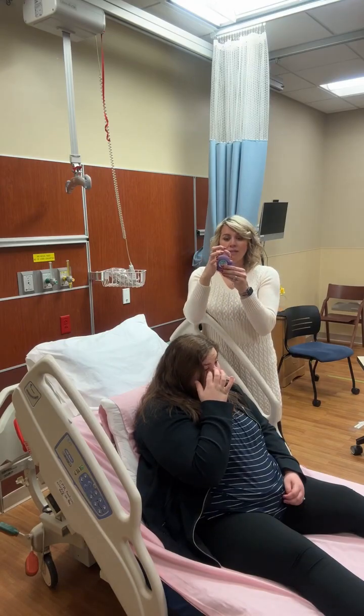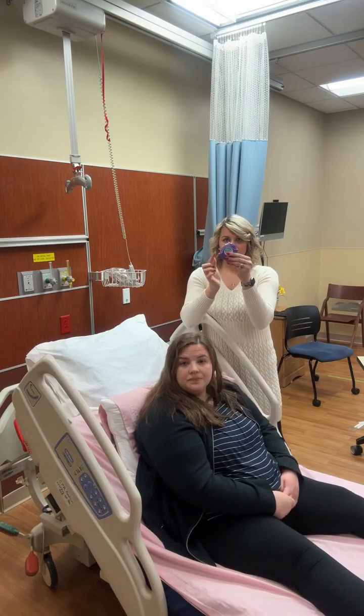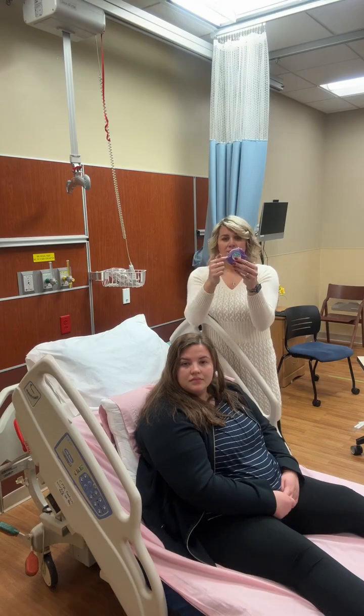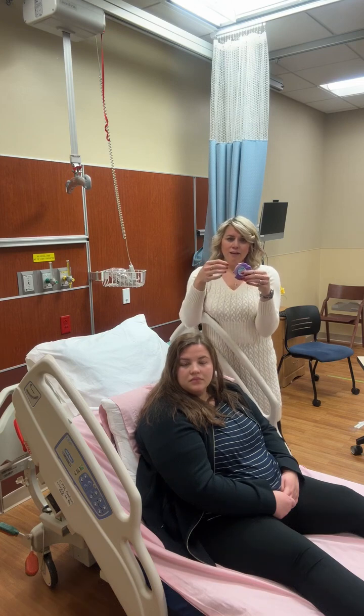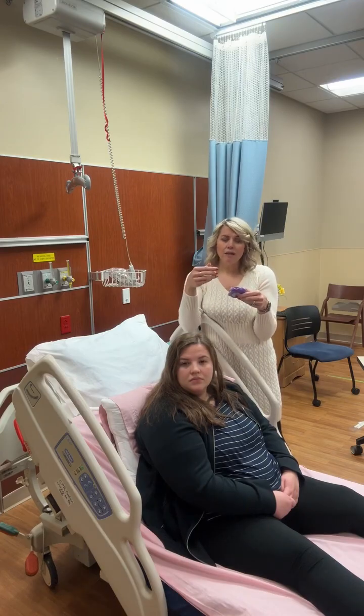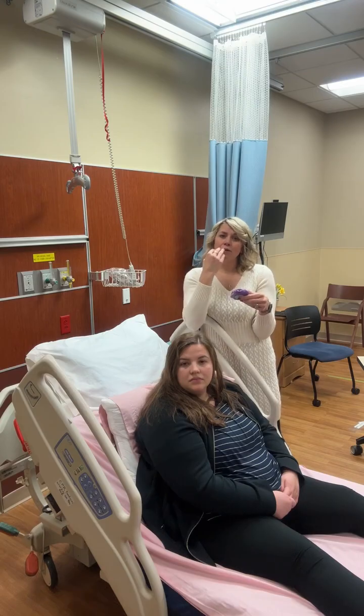So when we open this, like this, and then we pull this lever down, what we've just done is punctured a little capsule that has powder in it. And so when we do that, we've punctured the hole in the capsule so that the patient, when they put their mouth on this, will actually breathe in that dry powder.